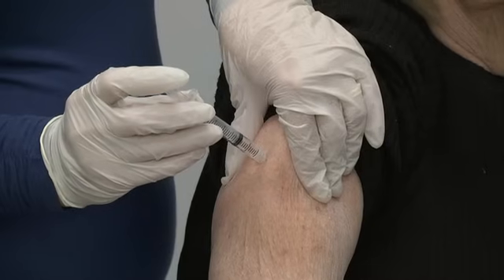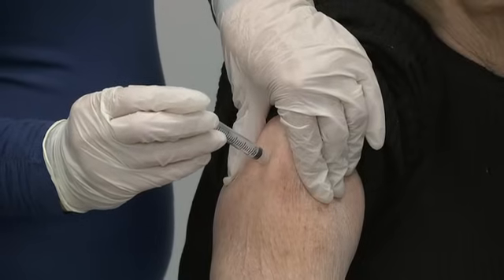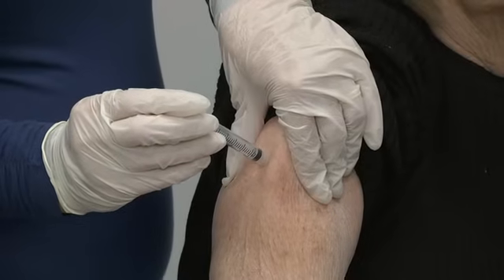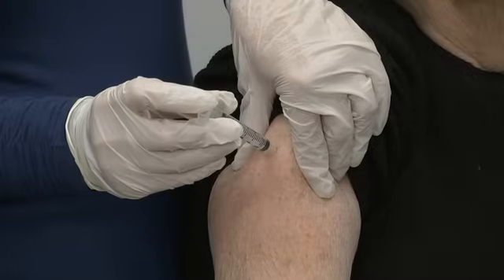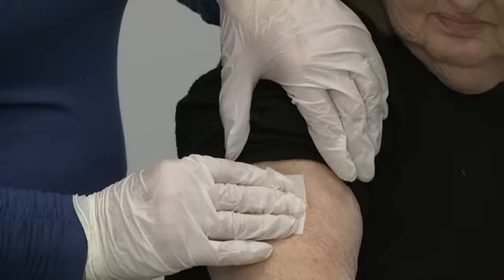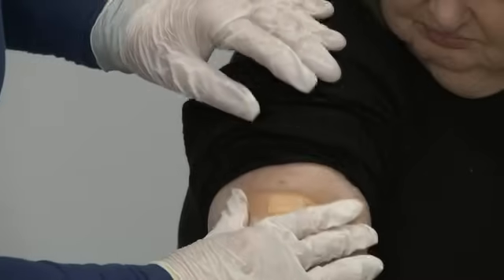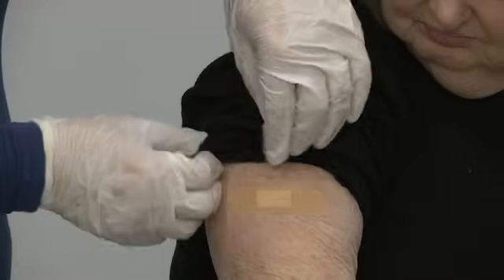Slowly push the plunger of the syringe until all of the medication is pushed out of the syringe. This should take less than 10 seconds. Count to 10, stop pinching your skin, and pull the needle out. You may bleed at the spot of the injection. If you notice bleeding, apply pressure with a clean alcohol wipe or cotton ball. Cover the injection site with a bandage if necessary.